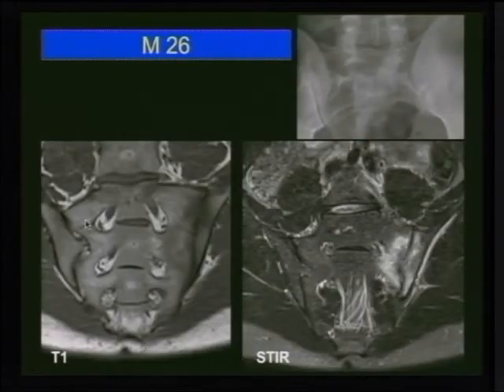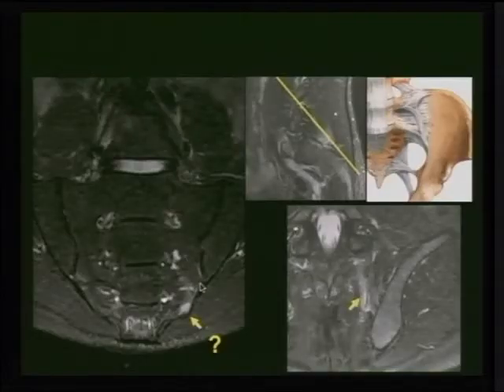The other point, the other patient is on the other side. So this one is low signal intensity on T1 weighted, bright signal intensity on the T2 fat sat or STIR images, and you can see them as well on the plain film. They are very normal. There is no abnormality detected at all. What we say here is that there is a focus of bright signal intensity on STIR. That means it is an edematous change, which was low signal intensity on T1. How can I explain that this one is arthritis? There is not much joint space in here. So what is the explanation for this? It is the attachment of the tendon or ligament. So this is enthesitis. So this case is an enthesitis case.